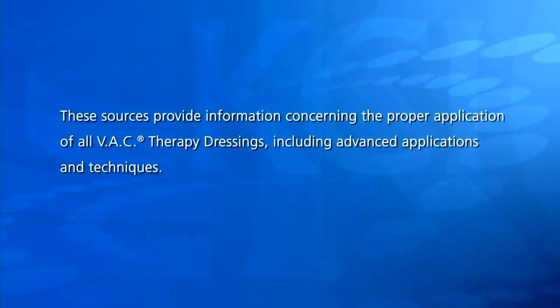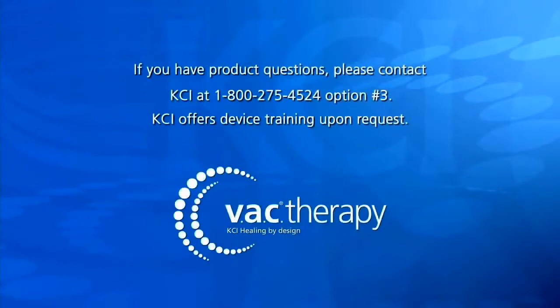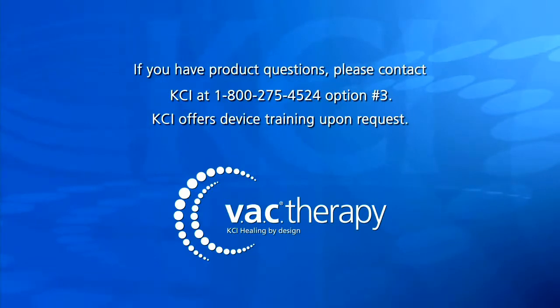These sources provide information concerning the proper application of all VAC therapy dressings, including advanced applications and techniques. If you have product questions, please contact KCI at 1-800-275-4524, option number 3. KCI offers device training upon request.